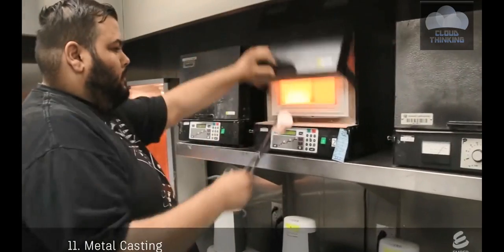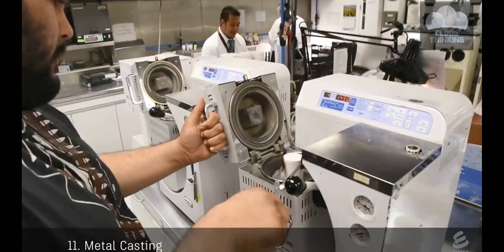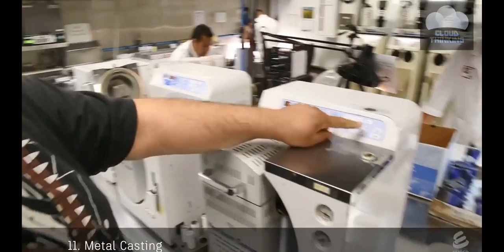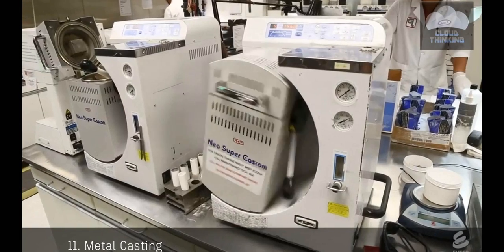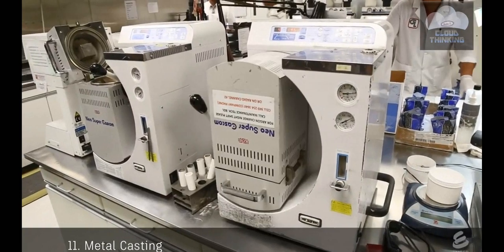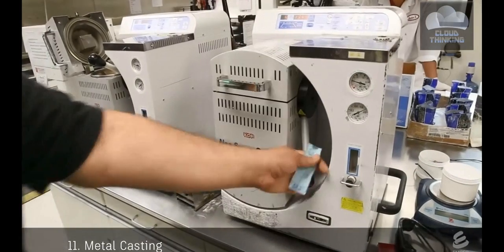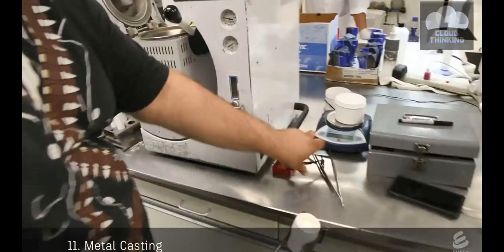Directly from the oven, the investment is inserted into a vacuum casting machine. Already inside is a precious metal alloy. The machine flips over and a vacuum pulls the molten metal into the void space. The casting is removed from the machine and left to cool.